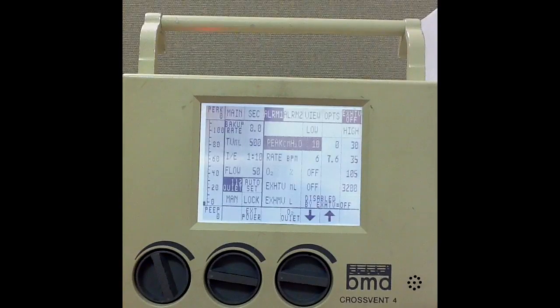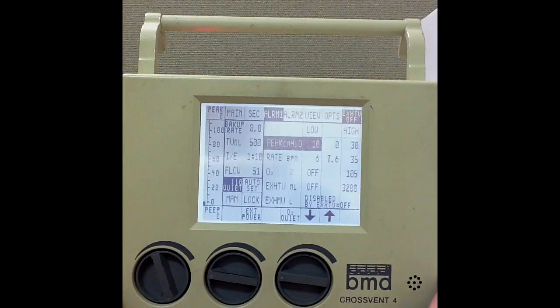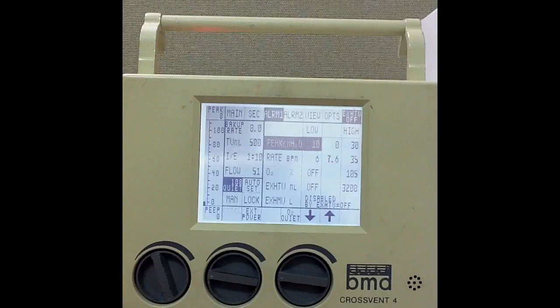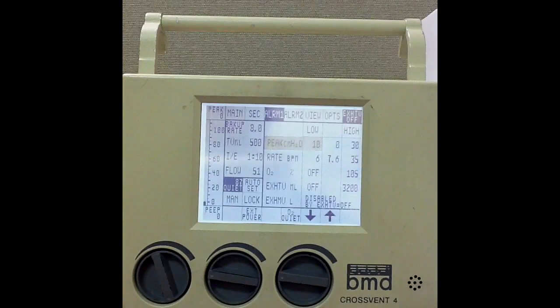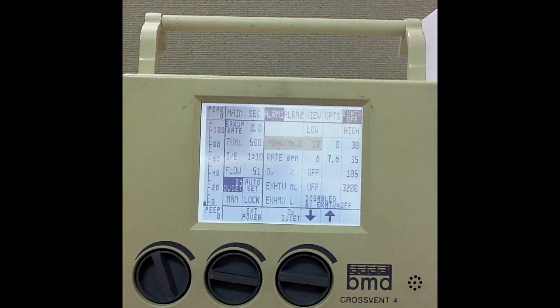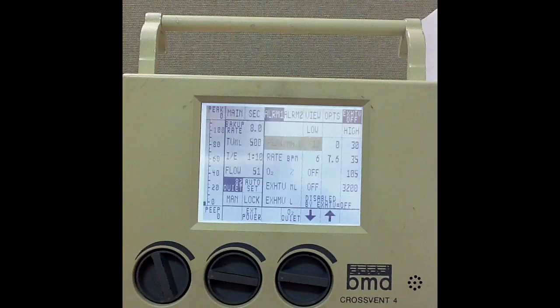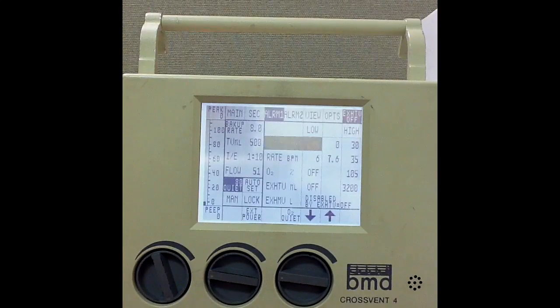That is the basic setup for an adult patient in volume control ventilation. Hopefully that makes sense for those of you having any issues with that. We'll go ahead and talk about pressure control here in a little bit. This is Chris back again with the Ancient Scholar. Today we're going to go ahead and initiate pressure control ventilation on a patient.